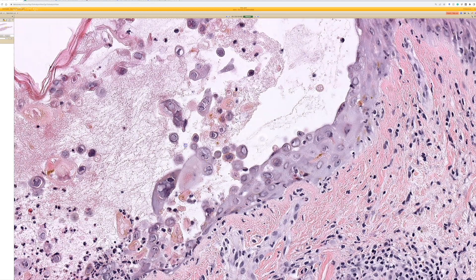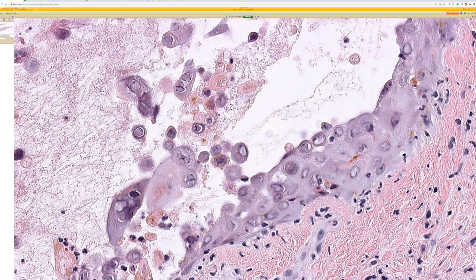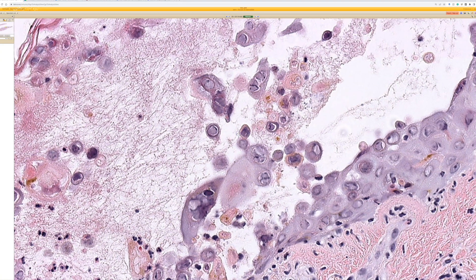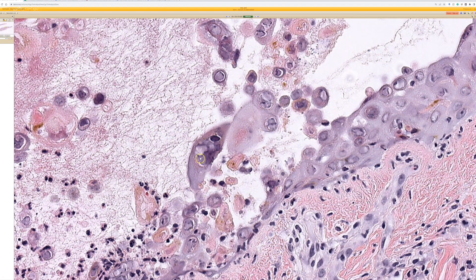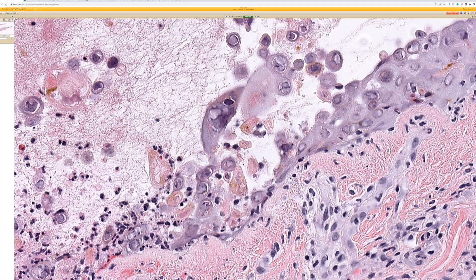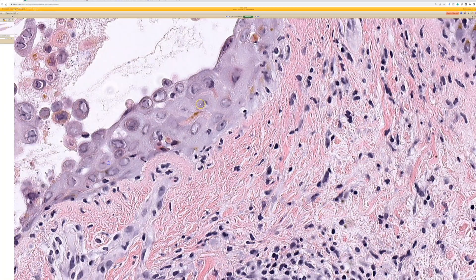This is really, really good cytology. Even with the lower quality scan, you can see good margination, dark border of the nucleus, the nucleus smashed against and molding against the neighboring keratinocyte nuclei — five or six nuclei clustered together in one cell, and they're all way bigger.